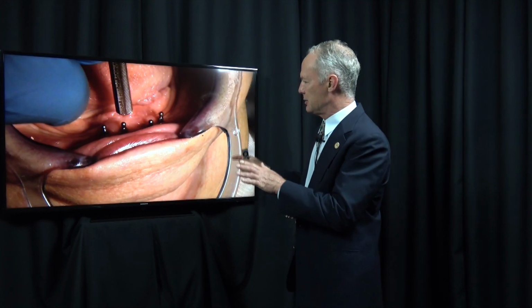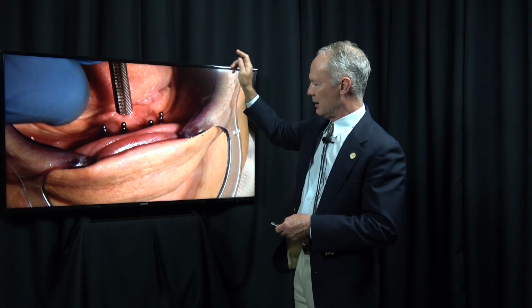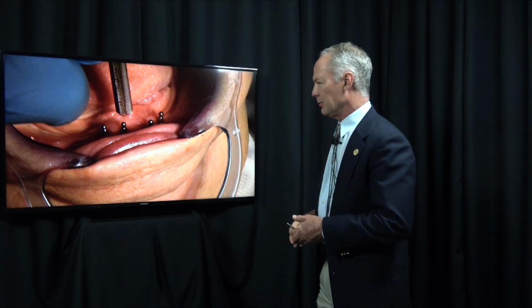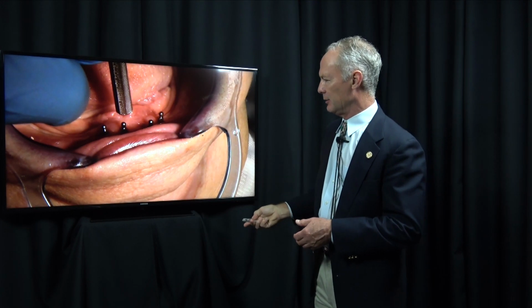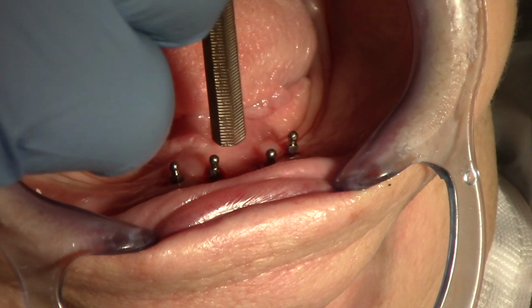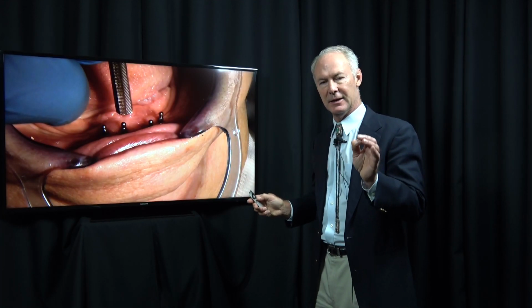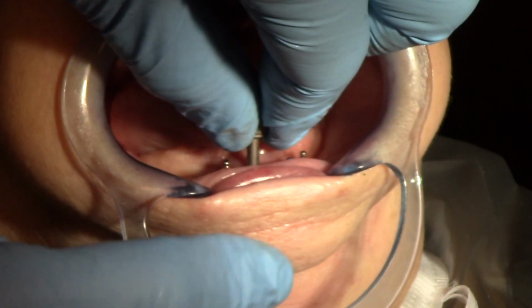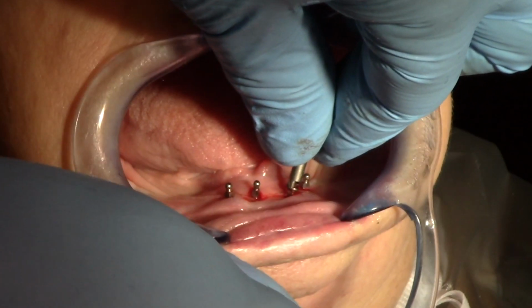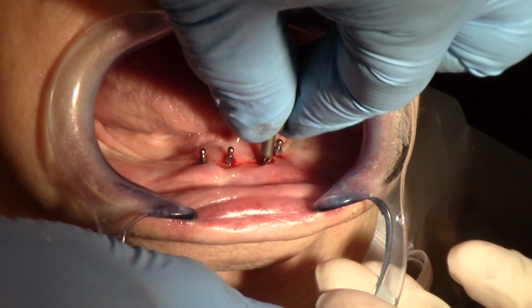So there are 2 ways to check and see if your implants are solid: 1, you can't turn the implant anymore with the finger driver or the finger wrench. Number 2, when you tap the implants with the end of a mirror handle, the sound should be ting, ting, ting, and not thud, thud. Ting, ting, ting. That's my favorite sound. Now I'm checking them with the finger driver, and I can't screw them in anymore. So these implants have a very, very high success rate.